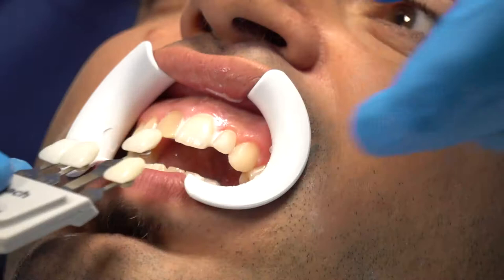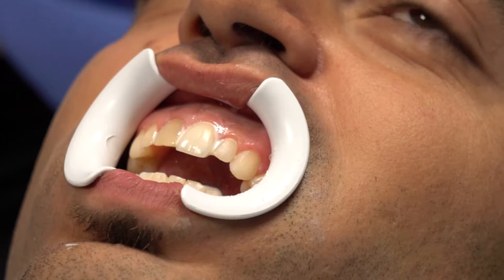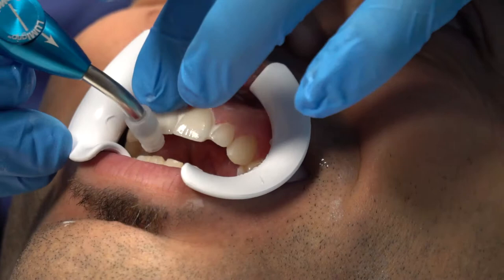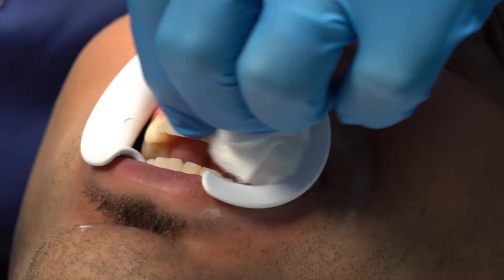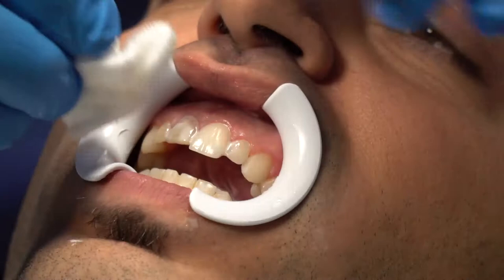Kevin, what's your thought? You like it? Okay, so now we have a base reference point of what we've got to match. This is the Supreme White Blockout put on the dark tooth now — so now both teeth have Supreme White Blockout. It's a little low, so we might want to build that up. I can start to see a little cervical area there. The dilemma is I'm going through this very slowly — obviously once we decide to place it, I've got to speed up.